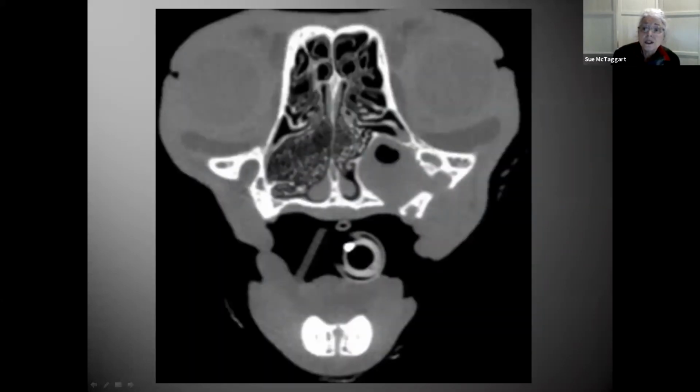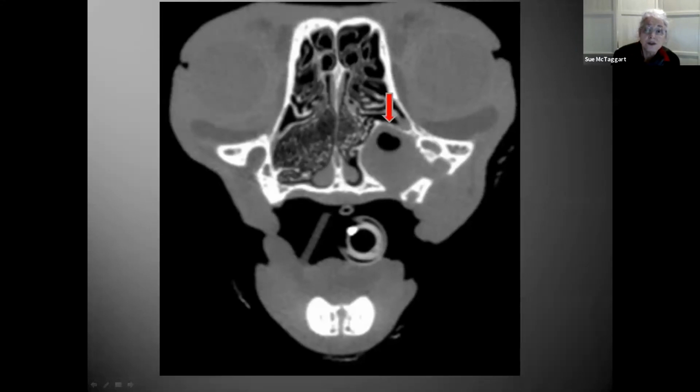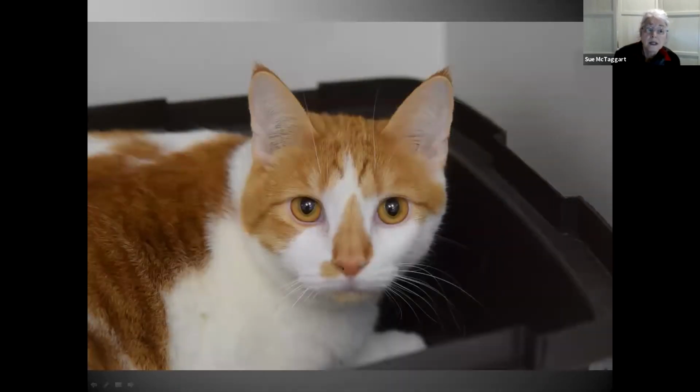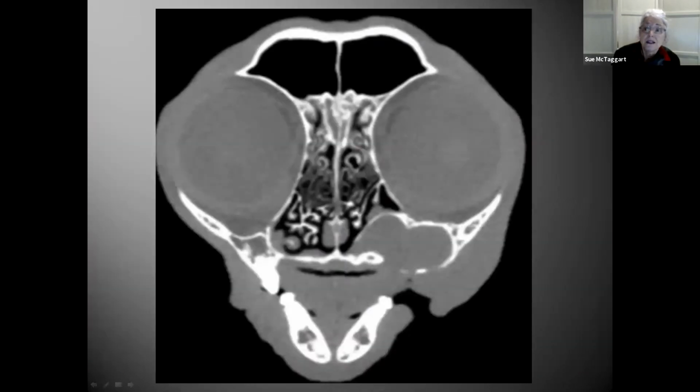So the tooth has been extracted via a window in the buccal bone guided by the cone beam measurements. And there's some air density that was apparent post-extraction. The osteotomy defect can be seen in this coronal view. So 6 weeks later, the cat came for follow-up and we were able to obtain another scan. And it shows the cyst is reduced in size.